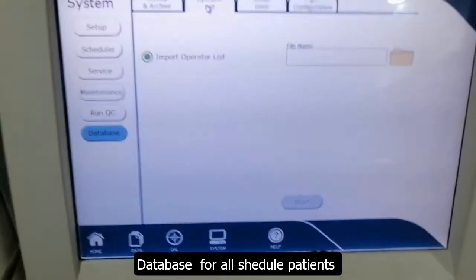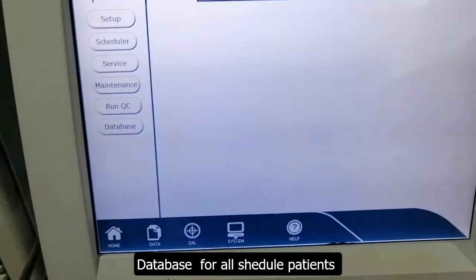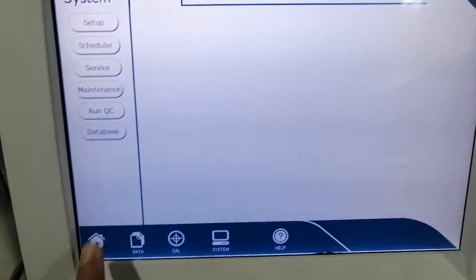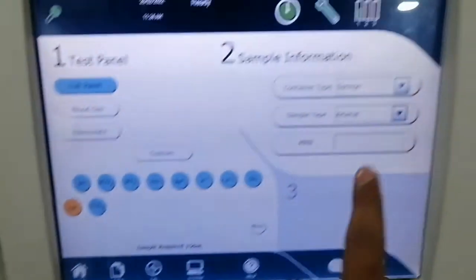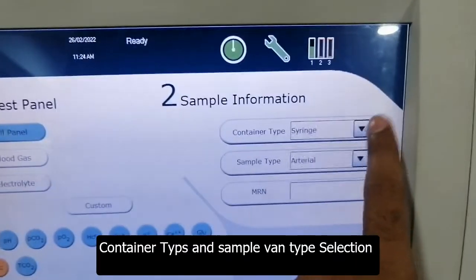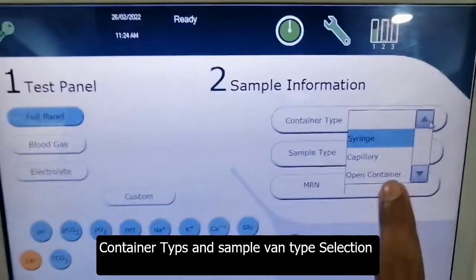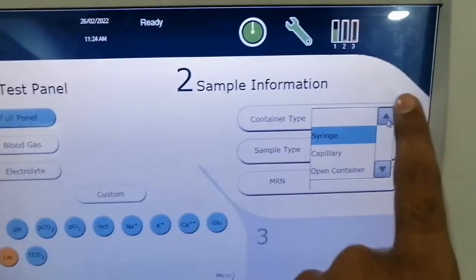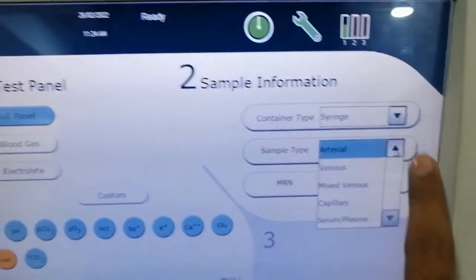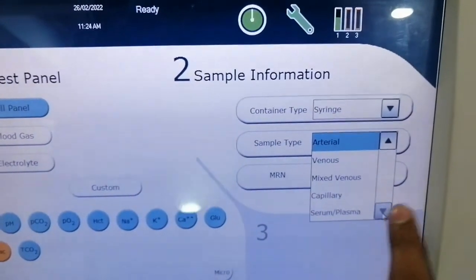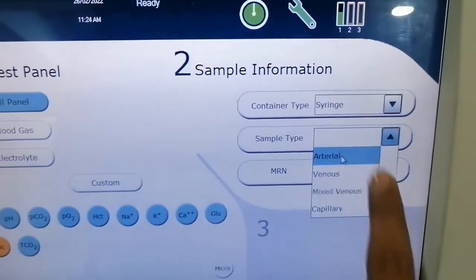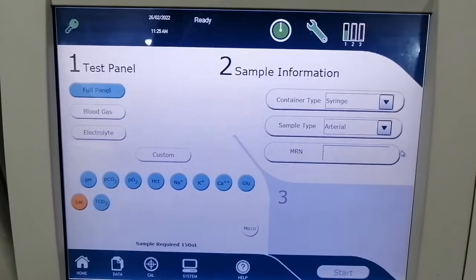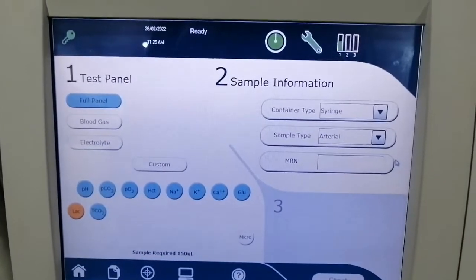Here are the main features of this machine. For the container type, you can put a sample from a capillary or an open container. These are the different sample modes — normally it is set to auto. As I explained, these are all the features of the machine and the main system.